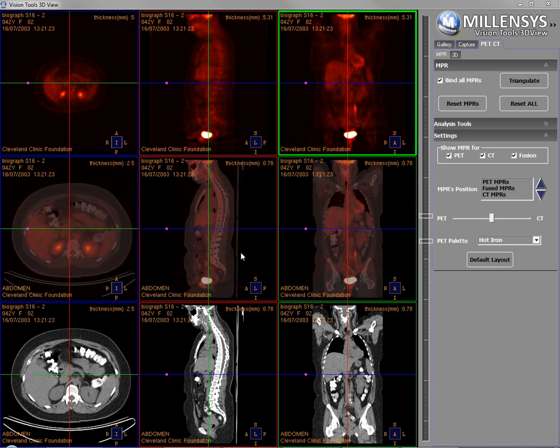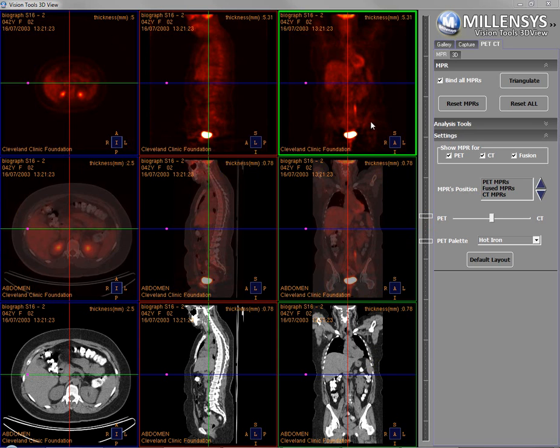Hello. In this video, we're going to discuss Mellins' PET-CT fusion software. PET-CT is a joint modality of PET, as you can see it right here, and CT that helps us visualize the anatomy and the activity in one view — that is the fused view here in the middle. We can see here the standard MPRs: axial, coronal, and sagittal of the PET, the CT, and the PET-CT fusion.